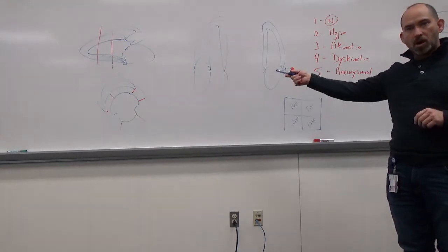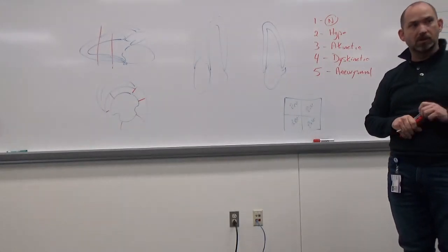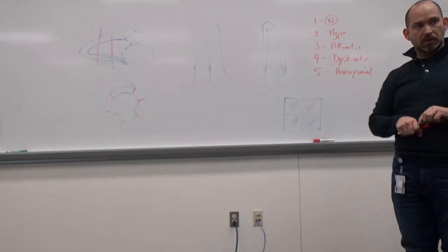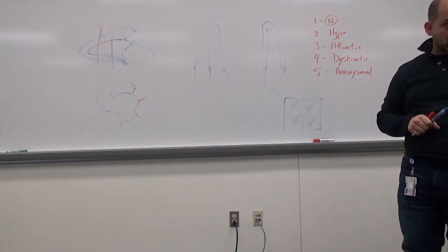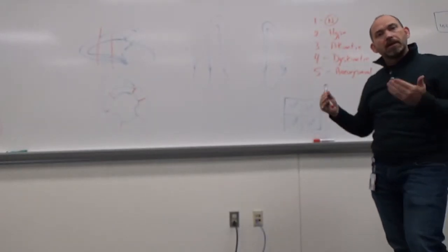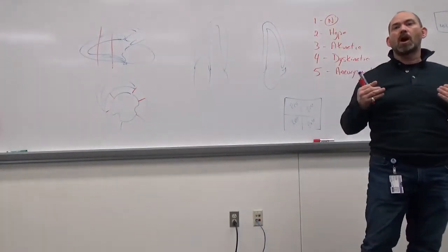Do we look at thickening of walls? Filling of the chambers. Okay, and how do we determine filling of the chambers? By the area, as well as outflow. Yep, so Doppler. So we're looking at hemodynamics. Nowadays we are actually starting to do a lot of post-exercise Dopplers.